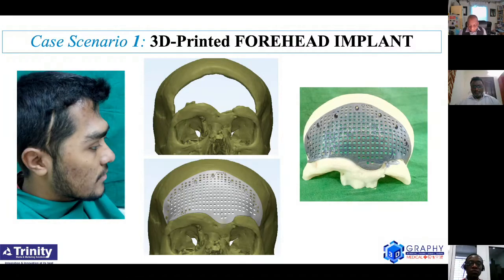But I had an answer because I have been working extensively with John, and that's the time I called on CTARs to understand if they could help us. And that's the time John gave me an answer with the help of titanium as a material of choice. This is what John fabricated.